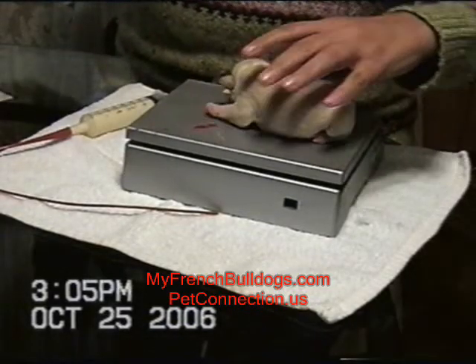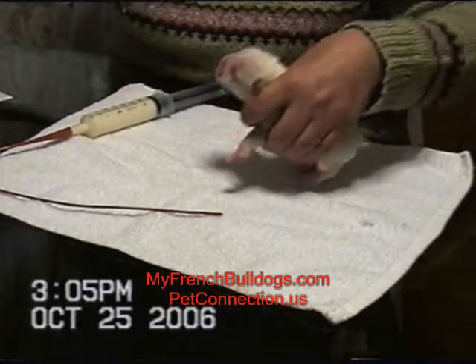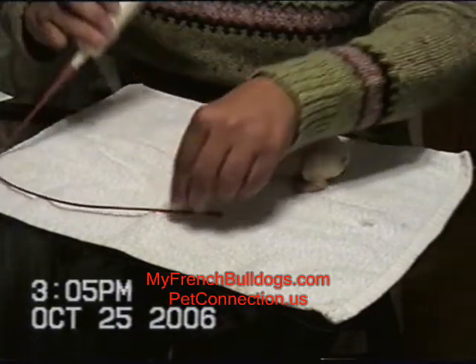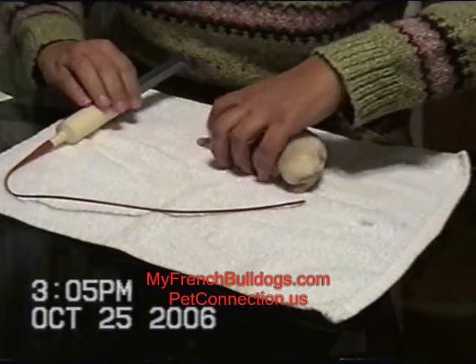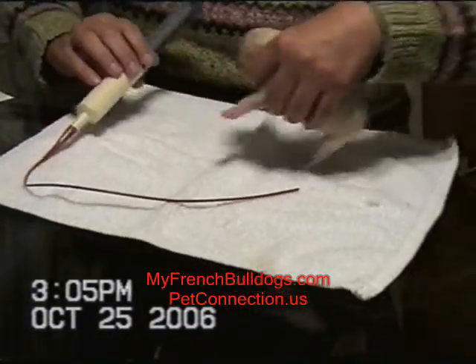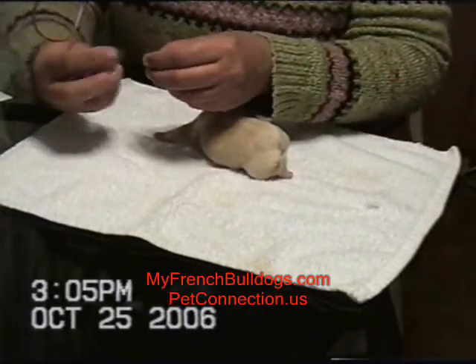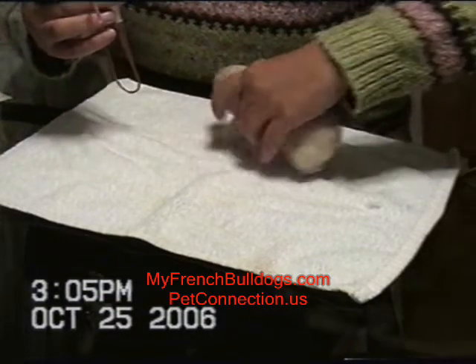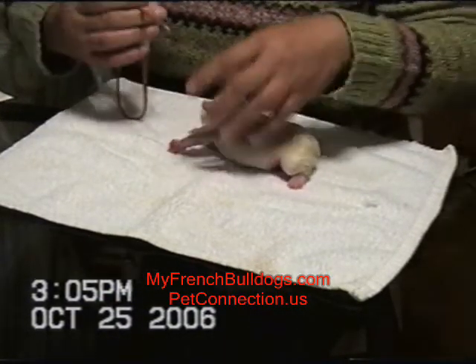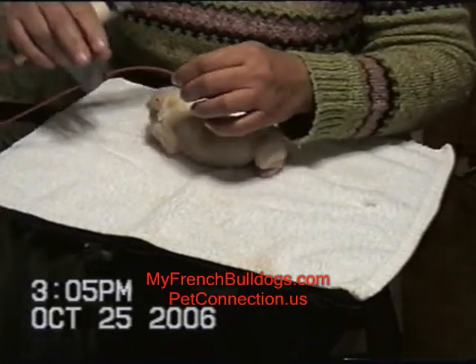First, we want to weigh the pup. The pup should be fed every three hours when it's a newborn so that they don't develop hypoglycemia. To calculate the amount to feed, take the pup's weight in ounces and multiply it by 4. That'll give you your daily intake. Divide this amount into the feedings in cc's that you'll give through the day. If the pup weighs 10 ounces, you'll feed 40 cc's all day long. 8 feedings a day would be every 3 hours, and you would feed 5 cc's every 3 hours.